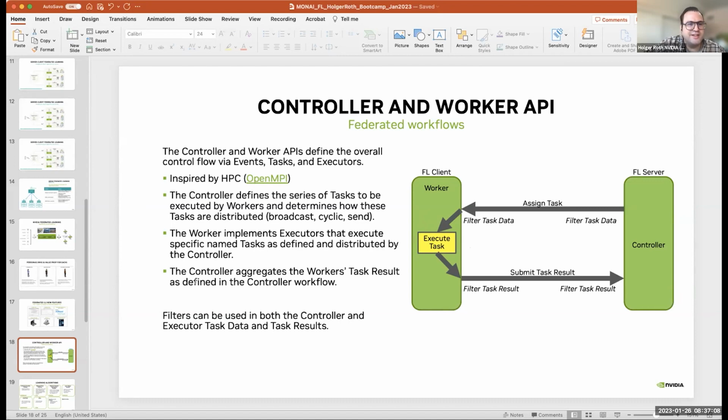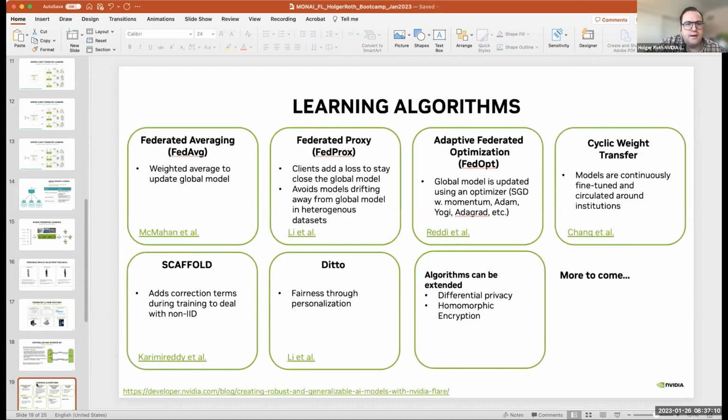Executing the task that has been defined. Within NVFlare, we have a lot of examples, not necessarily in medical imaging, but more general FL applications that show different algorithms. Not all of them are currently implemented in the MONAI FL MONAI algo. So there's something where we can also ask for help from the community. Maybe we need some more work to support all different variations, right?